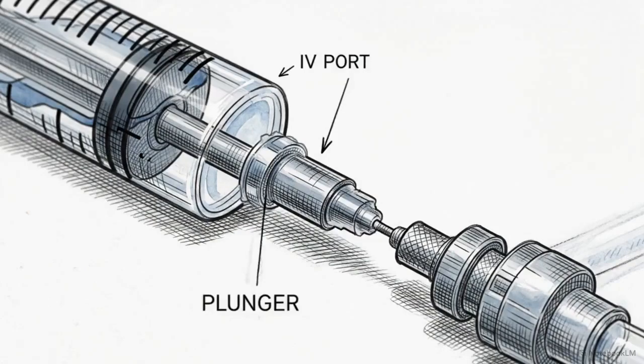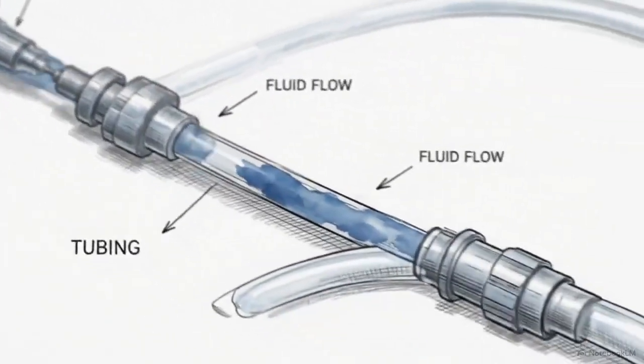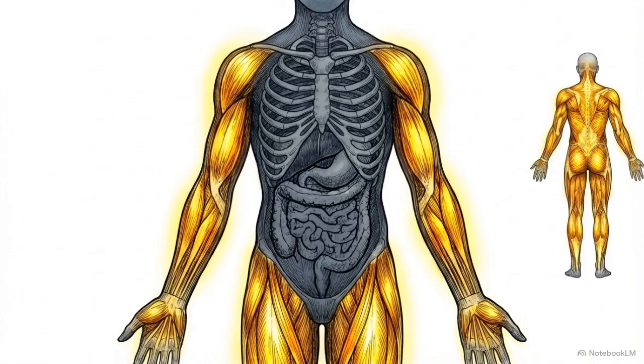Faced with a hyperglycemic patient, the seemingly logical clinical fix is to administer insulin right before the scan to lower their blood sugar. But insulin is indiscriminate. Its systemic mechanism drives all circulating glucose directly into skeletal muscle tissue, and it takes the FDG tracer right along with it. The resulting scan is useless for oncology. You see a diffuse, intense uptake saturating the patient's skeletal muscles, draining the radiotracer away from the internal organs you are trying to evaluate.